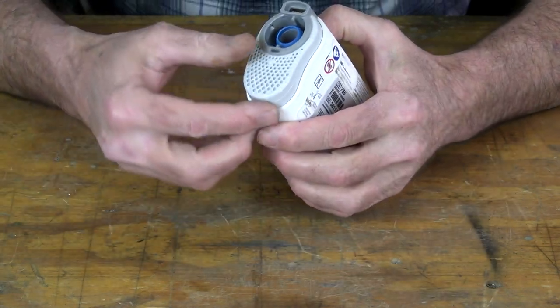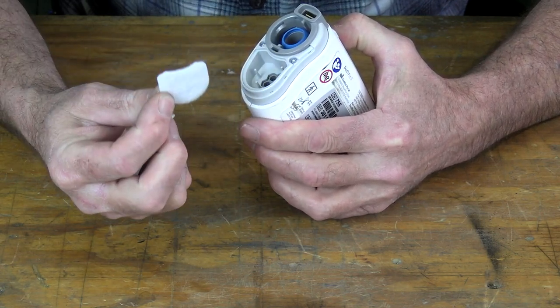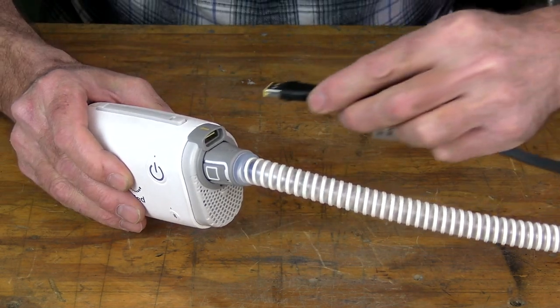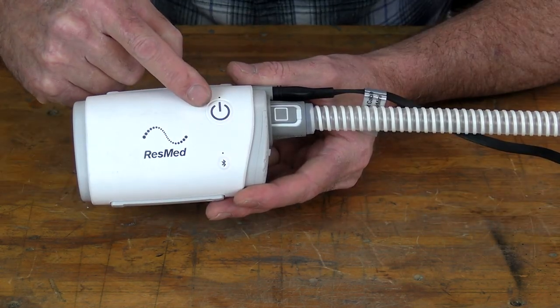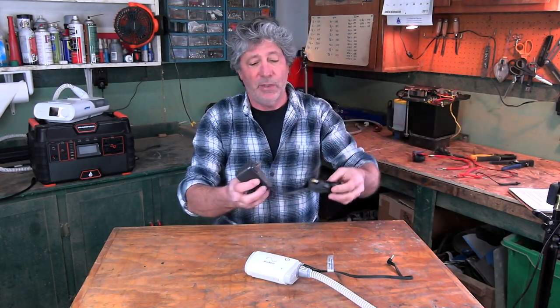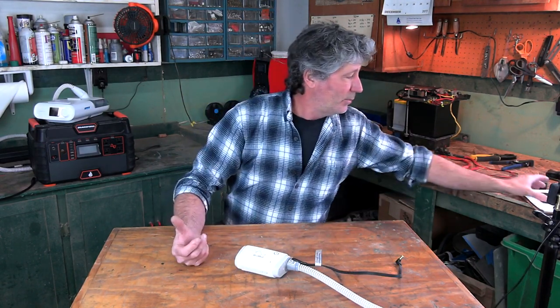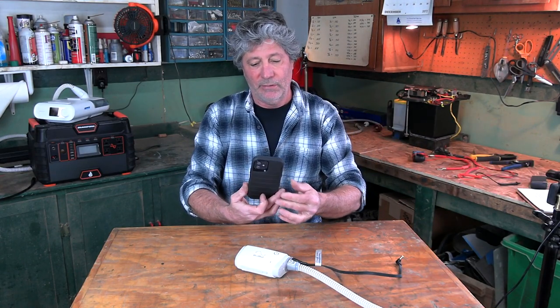At the air intake there's a replaceable filter behind this little panel right here. The hose hooks up here and clicks in, and the power cord plugs in right there. Power button is right there. It also comes with an AC power cord in case you're around electricity, like in a motel room. Like most everything else, this is Bluetooth-connected to an app on my phone, which gives me all the stats.